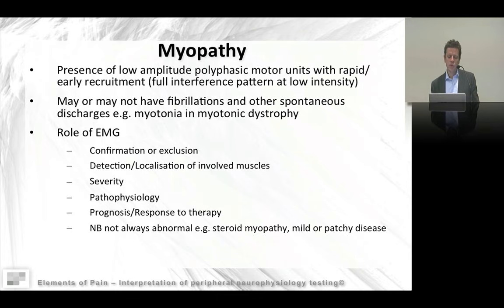In myopathy, EMG can occasionally be a bit hit and miss for a number of reasons. You sample a very small area of muscle, and so it's good for neuropathic conditions which tend to have more widespread distribution by units, but myopathic changes can be more anatomically discrete, so you might miss changes. There are also some myopathic conditions which don't have many EMG changes, such as steroid myopathy.